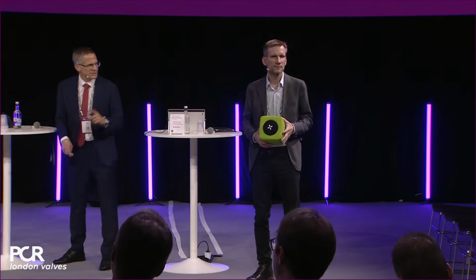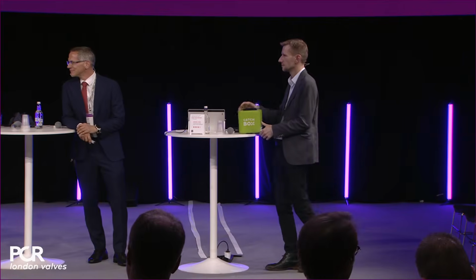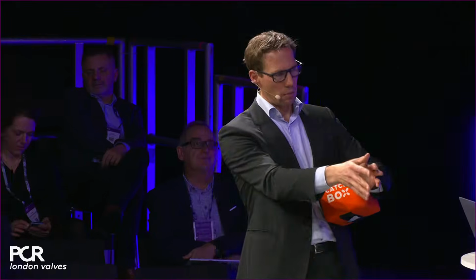Are there any strong believers in 34, who is convinced I would only take 34? Because we would like to hear the argumentation for that. Well, it's me. Okay, so we're going to hear the argument, and then you can comment on it. Let's be honest, if this wasn't the study when we studied the old CoreValve in bicuspid, the screening committee would have told us to put a 34. But I don't think there's any penalty here, right? I don't think so. You've got large sinuses, your coronaries are not at risk. We're going to hear a little bit about the age of the patient and whether they had prior conduction disturbance, risk of pacemaker, etc. I think both valves work well here.